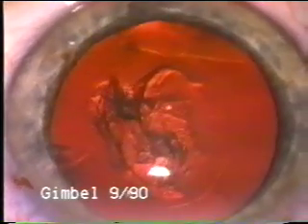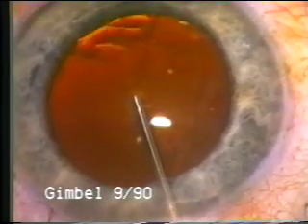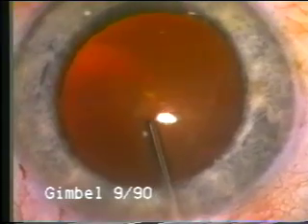For your first few cases I would definitely recommend a viscoelastic, because this helps to neutralize the vitreous pressure and maintain adequate room in the anterior chamber for maneuvering the instruments. When you first start, you want to use a capsule forcep and you need adequate room in the anterior chamber. Here we're using Orcalon, which can be recognized by its very definite noodling as it goes into the chamber before it fills — this has left us adequate room for the capsule forcep.